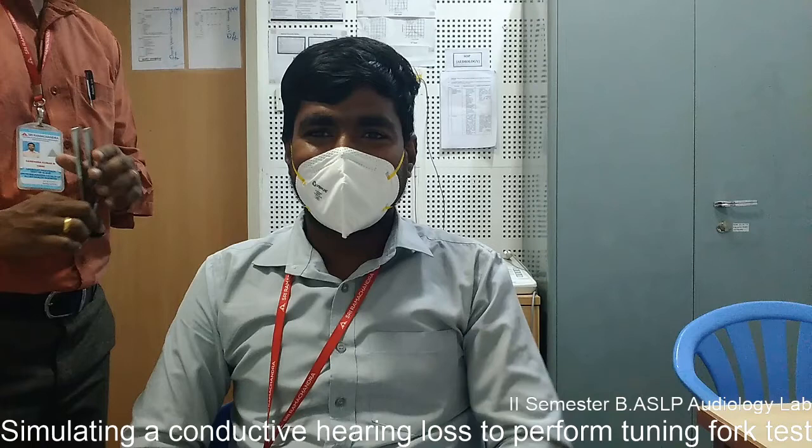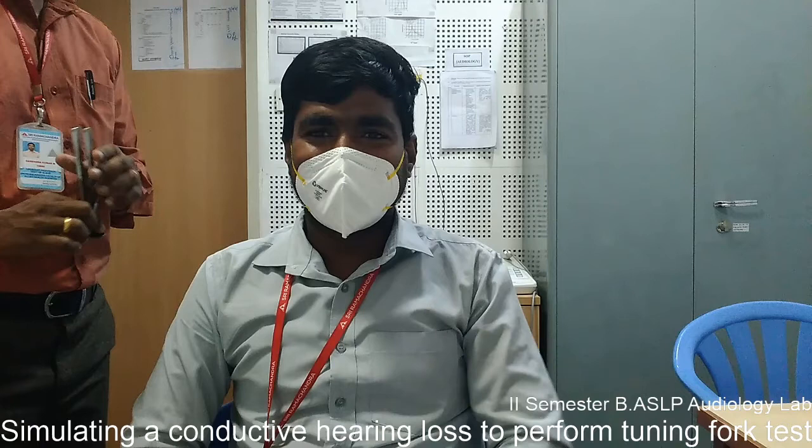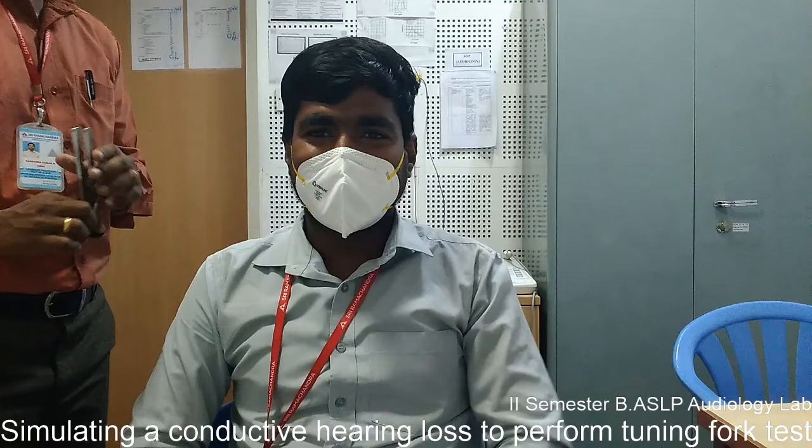On the left side, bone conduction was perceived much better. Based on air conduction hearing, the right ear has better hearing and the left ear has poorer hearing. In the Weber test, the sound lateralizes towards the poorer side.